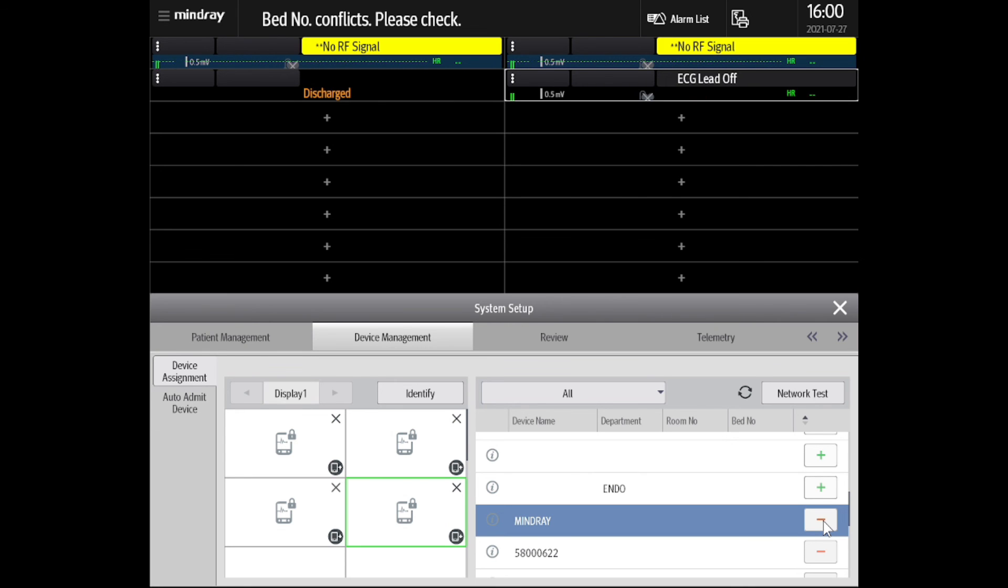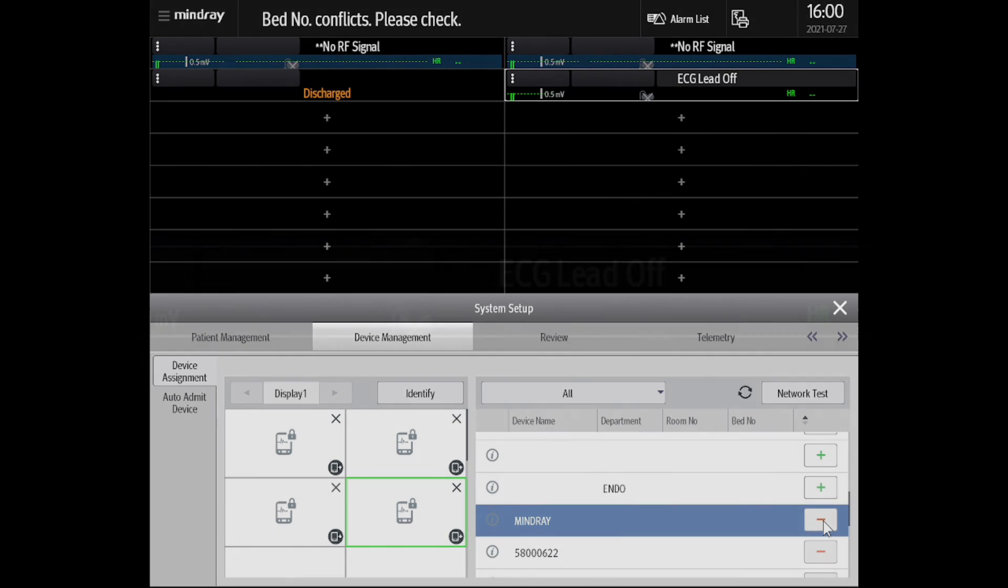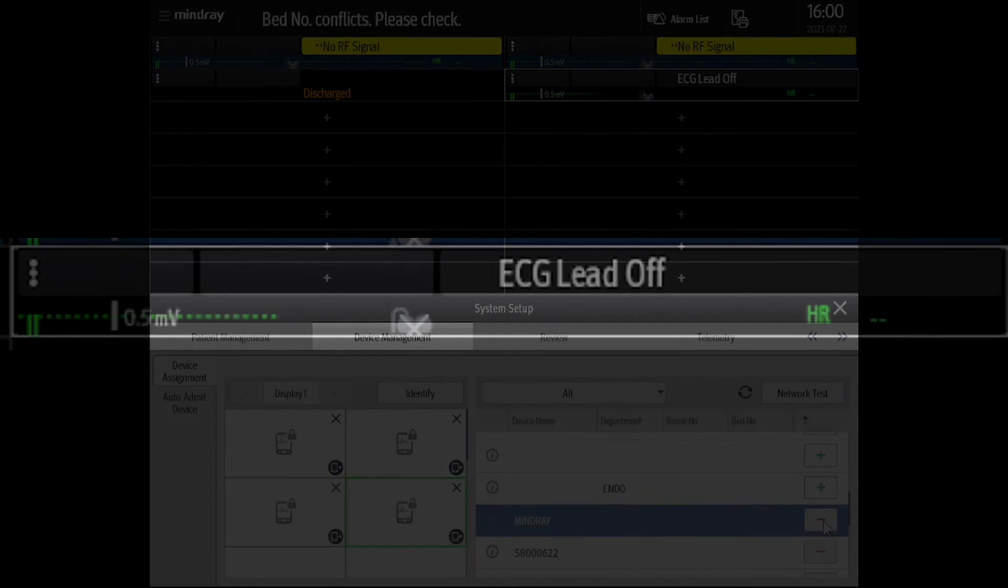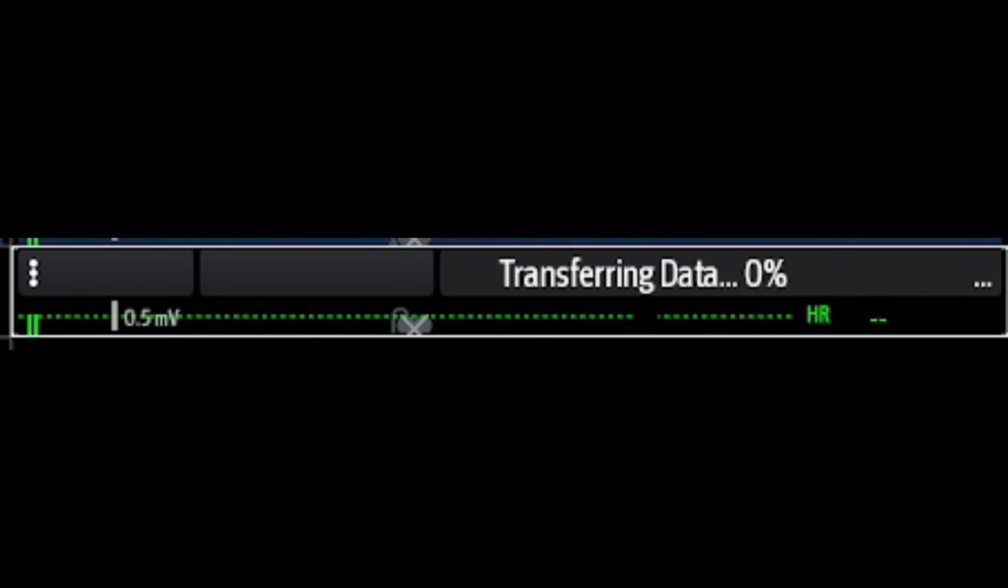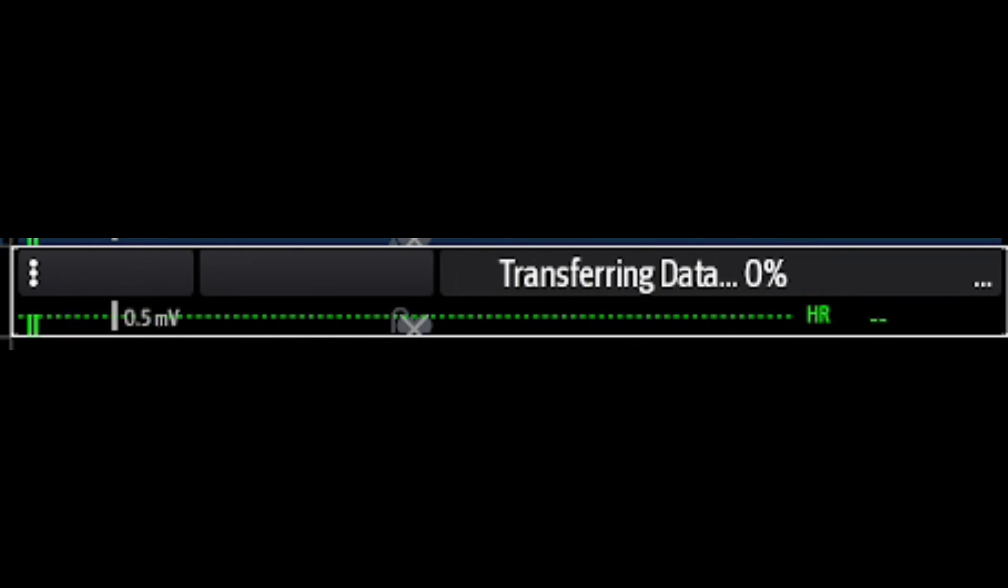You will see in the table the TM80's display now showing on the dedicated tile. Your TM80 replacement at your central station is now complete. Proceed to add this device at the appropriate workstations.